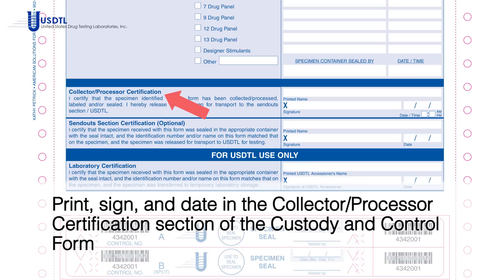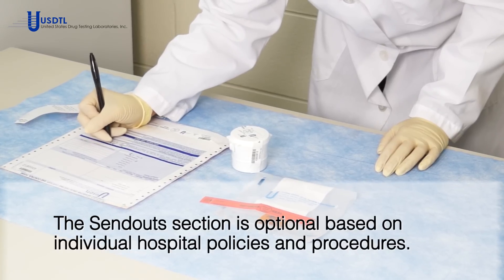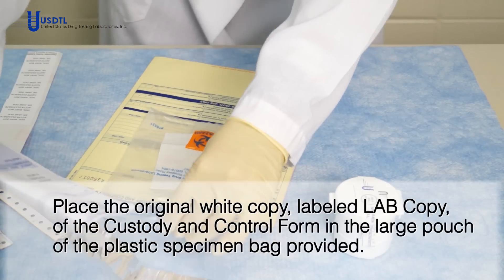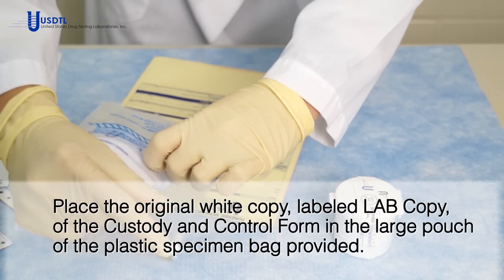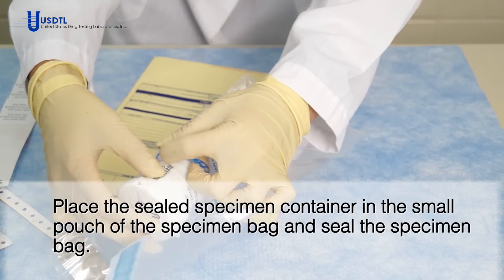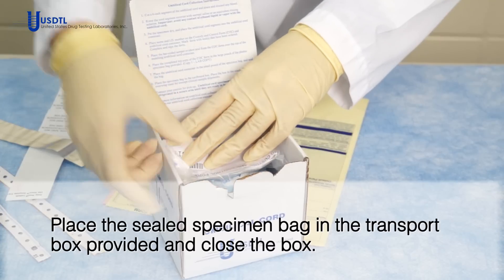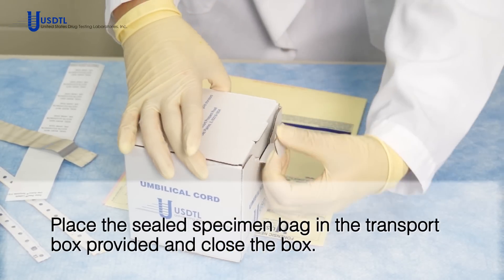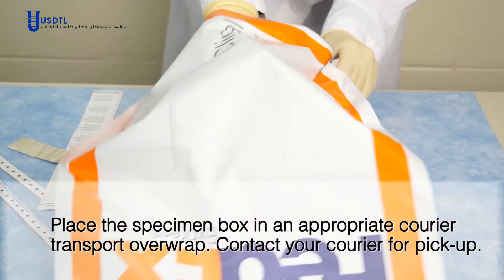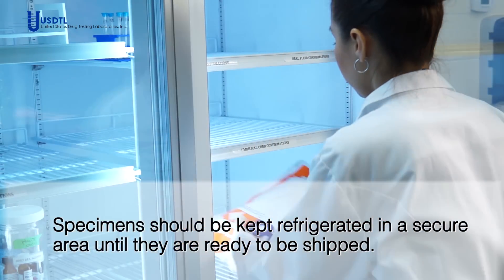Initial and date the tamper evidence specimen seal. Print, sign, and date in the collector processor certification section of the custody and control form. The send-outs section is optional based on individual hospital policies and procedures. Place the original white copy labeled lab copy of the custody and control form in the large pouch of the plastic specimen bag provided. Place the sealed specimen container in the small pouch of the specimen bag and seal the bag. Place the sealed specimen bag in the transport box provided and close the box. Place the specimen box in an appropriate courier transport overwrap and contact your courier for pickup. Specimens should be kept refrigerated in a secure area until they are ready to be shipped.